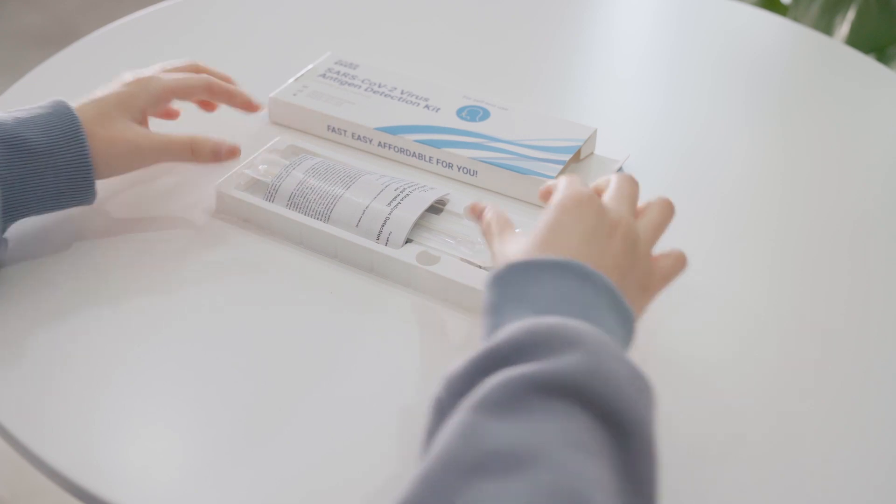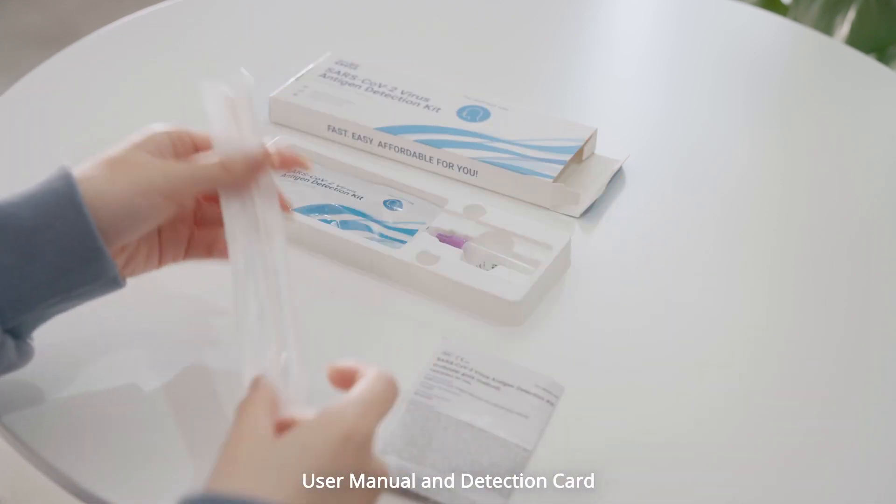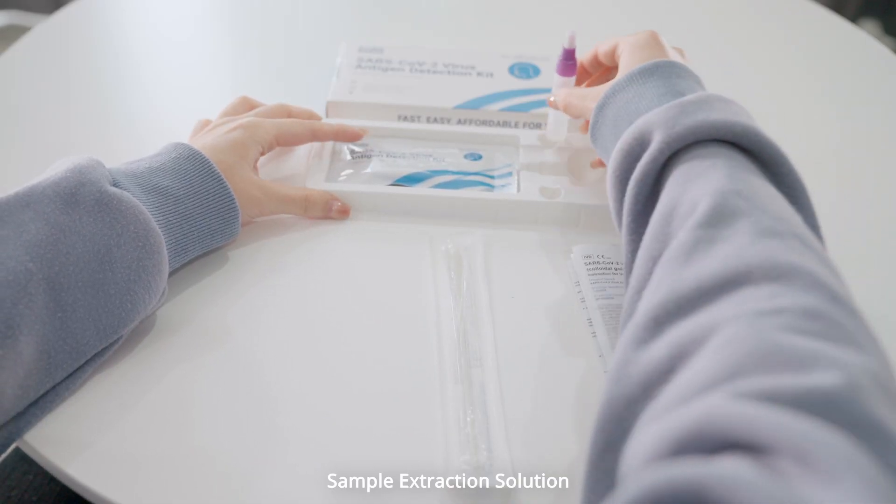Open the package. This kit contains a user manual and detection card, swab, and sample extraction solution.